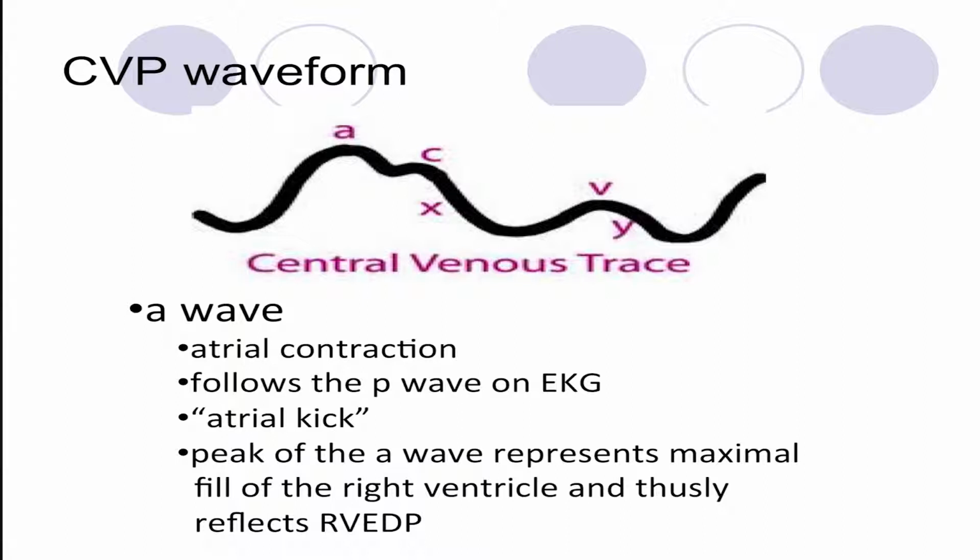So CVP waveforms. We talk a lot about CVP. When I get calls, we talk a lot about what's their CVP running, but you get so much more out of a CVP than a number, and we'll talk a little bit later about why that number means absolutely nothing, and we've proven that. But what you do get is this beautiful waveform that nobody ever looks at. It's a continuously running echo on your patient that we pay no attention to.